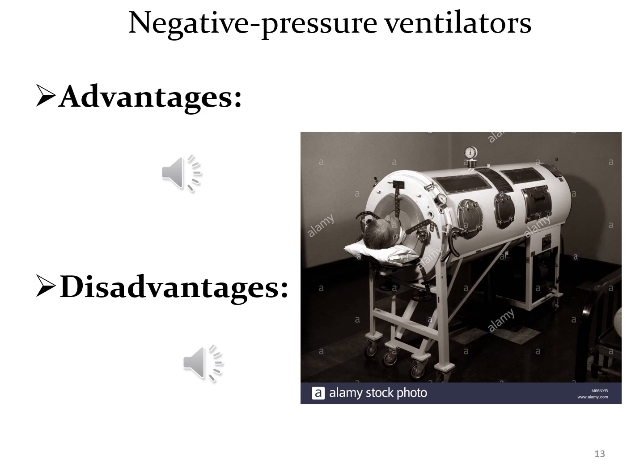Advantages of the negative pressure ventilators. More physiological. The ventilation was carried out without the installation of a tracheotomy or endotracheal probe. Non-invasive mechanical ventilatory techniques, and patients can talk and eat normally.